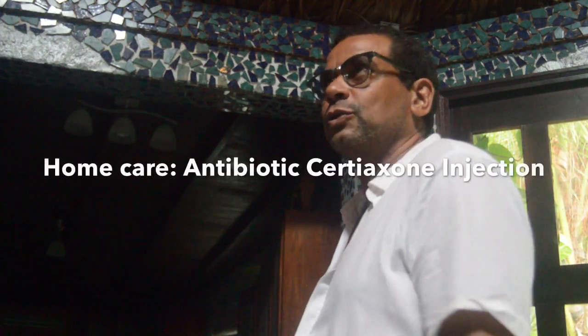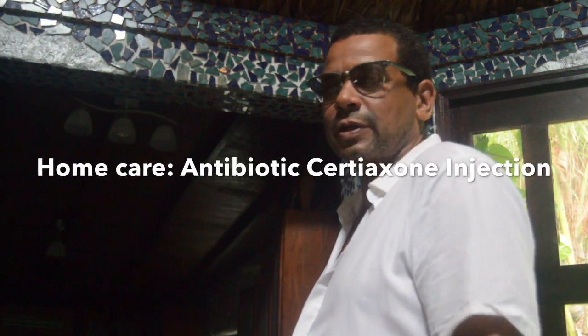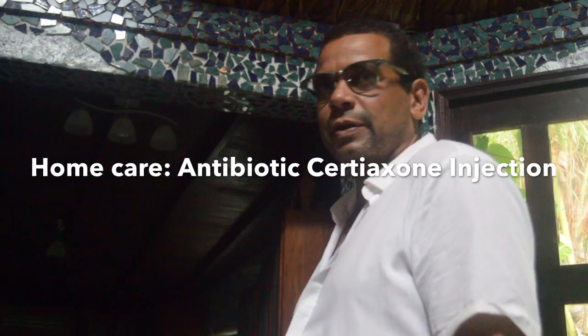Today is how to administer antibiotics through a catheter. We live in a remote area, so we don't always have access to a doctor or medical help. There's not a nurse around, and sometimes you have to administer medication. So what we're going to do is administer an antibiotic through a catheter.